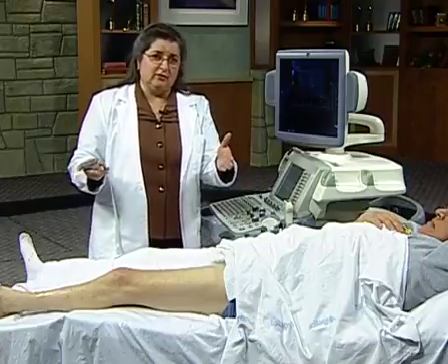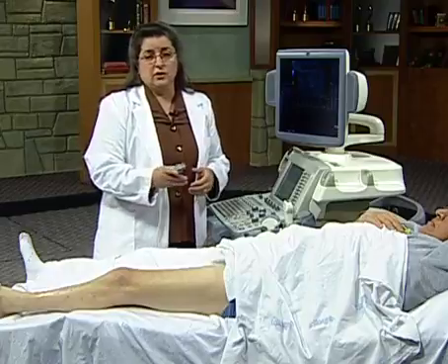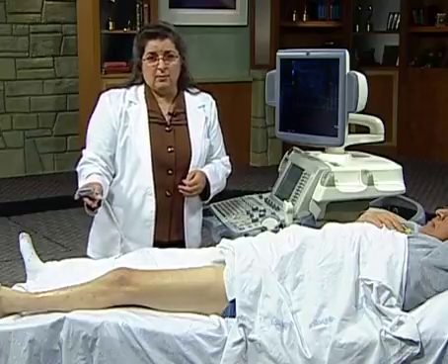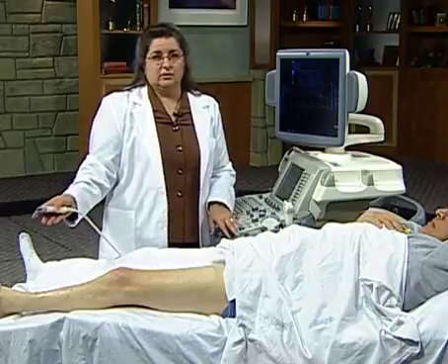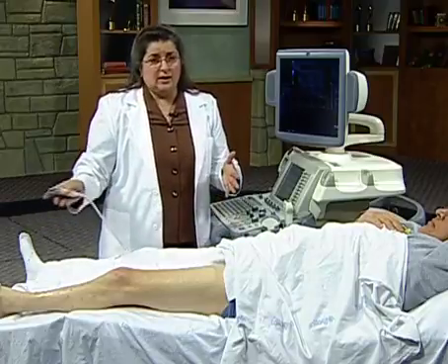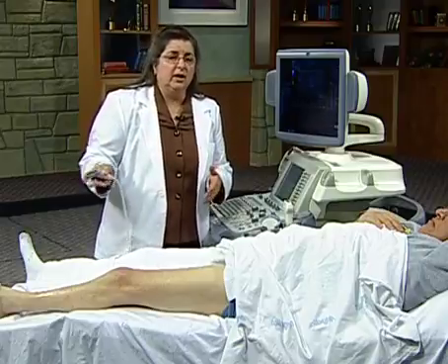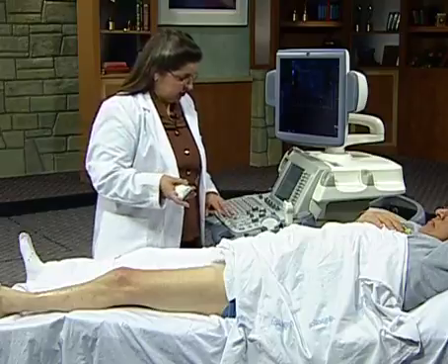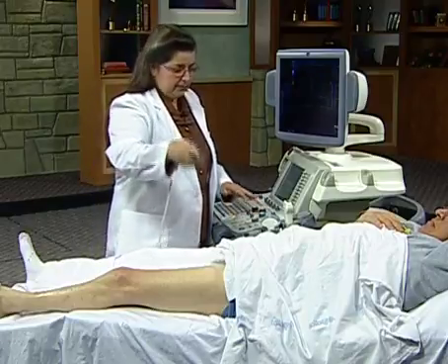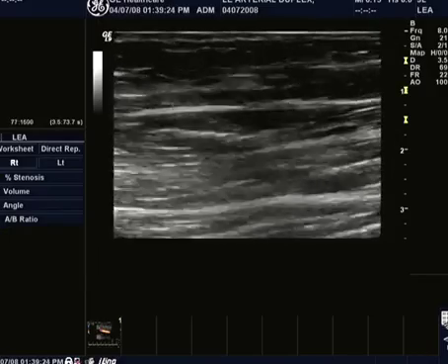We started in the inflow vessel, which was the common femoral, went through the anastomosis, went through the entire length of the bypass graft, out the distal anastomosis and out into the distal artery. We evaluated segments of it in color. We looked at the whole thing in spectral Doppler. And as I said, some people will scan the whole thing in color as well. We can show you that. We've got a little time. We'll just show you how we would follow it in color.